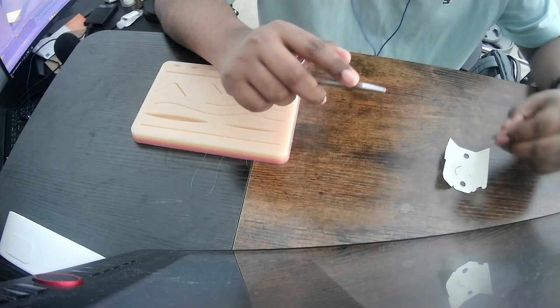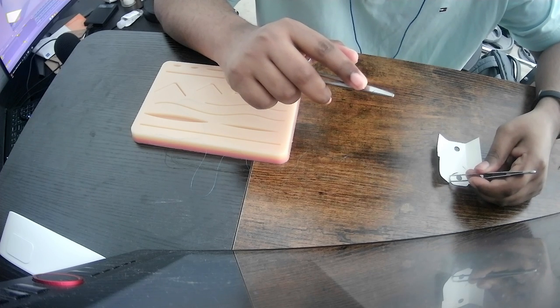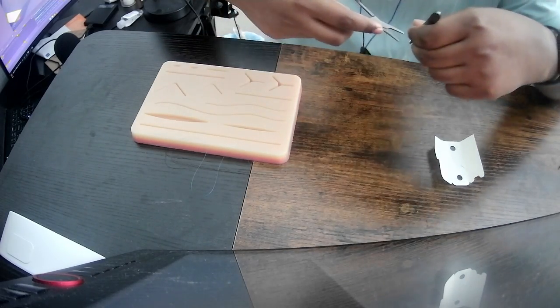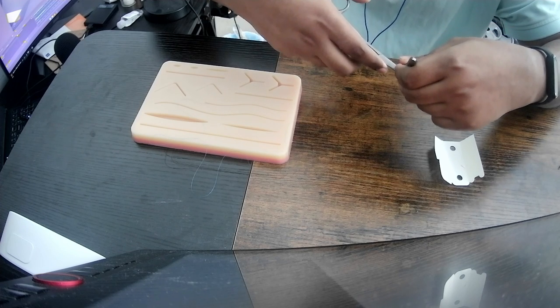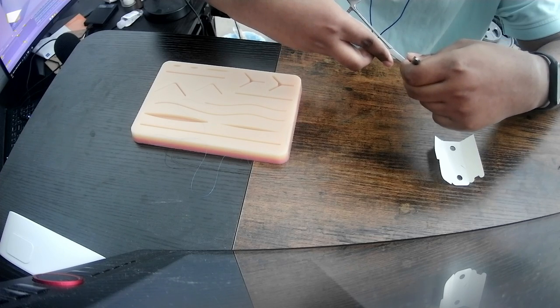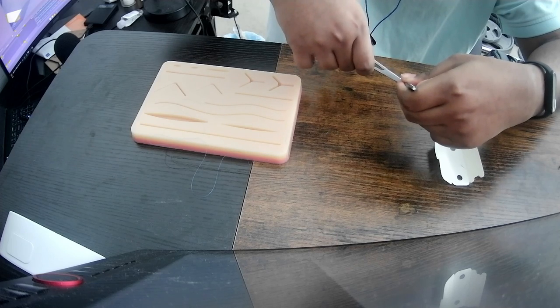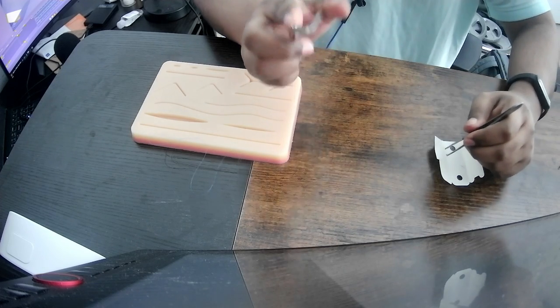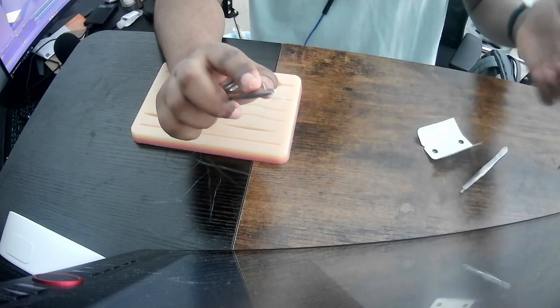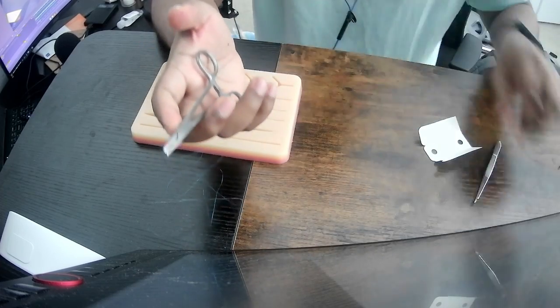Which means, let's go nice and easy. Needle driver is set about one third of the way in. Angle it just right. Once ready, needle loaded and ready. Nice. So yeah, right hand is no problem. It's just the left hand. I'm still getting used to operating the needle driver one-handed, so you see how important it is, because your other hand is busy with this.